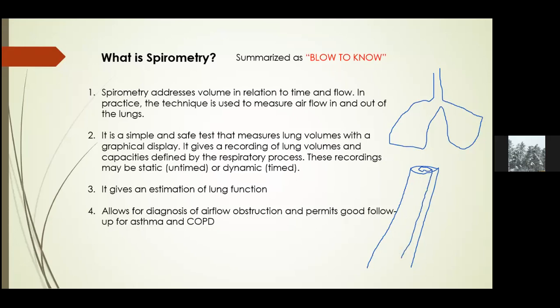Now, if it becomes limited, then it will have an impact on the volume of air that can pass there. For that reason, you can use spirometry to determine if you have this type of congestion. Do you have any resistance within your airways? If I tell you to inhale, you will have a problem allowing air to move in because of the restriction of the airways.